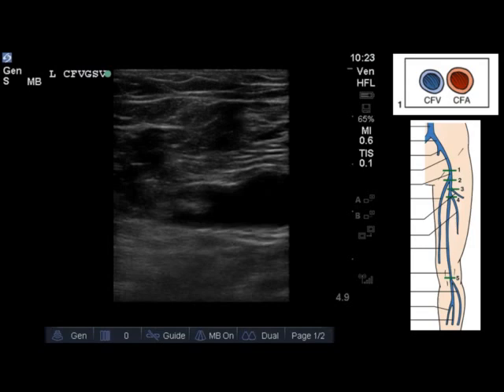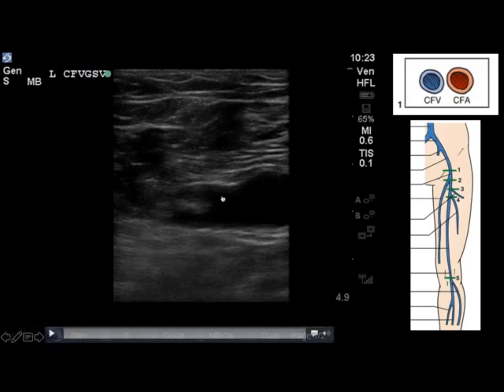Moving on to a separate exam also acquired during my time on elective in London, we're actually going to see a positive study result. As the label would suggest, this is the common femoral vein in the patient's left leg. You can see the common femoral artery and the common femoral vein medial to it, and you can sort of imagine the takeoff of the greater saphenous vein at this level.